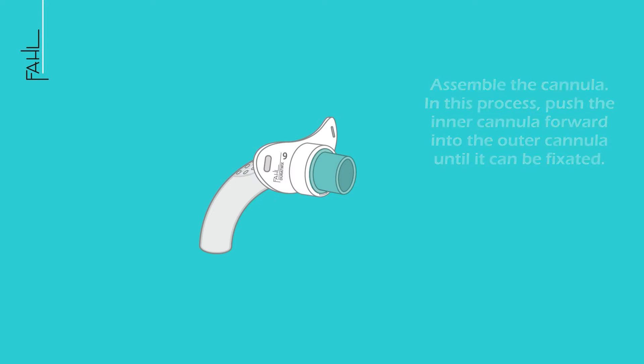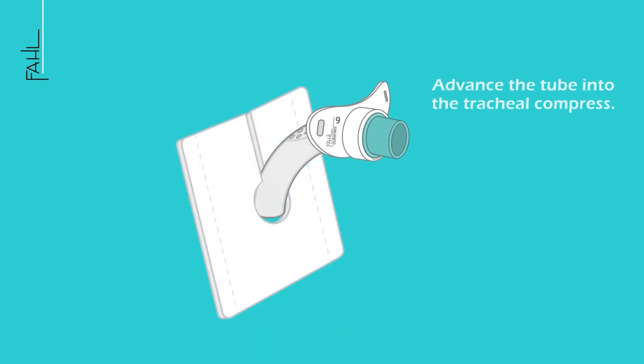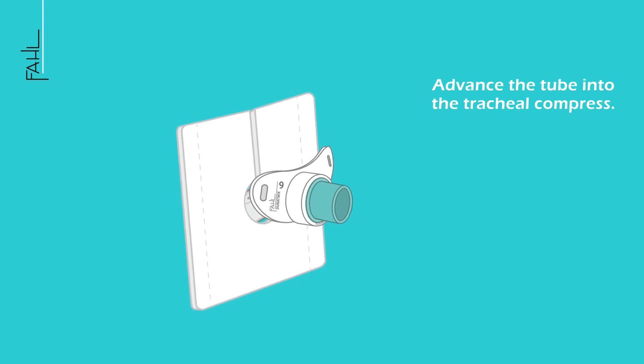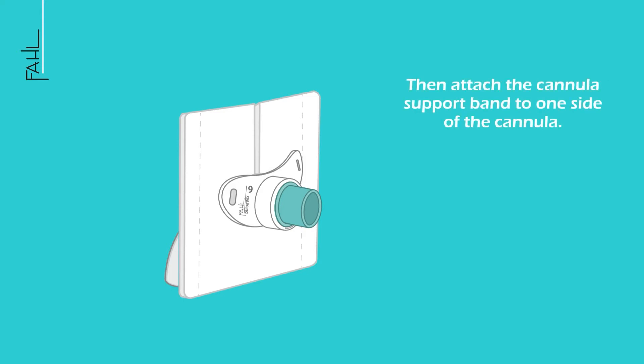Assemble the cannula by pushing the inner cannula forward into the outer cannula until it can be fixated. Advance the tube into the tracheal compress, then wet the outer cannula with the lubricant. Attach the cannula support band to one side of the cannula.